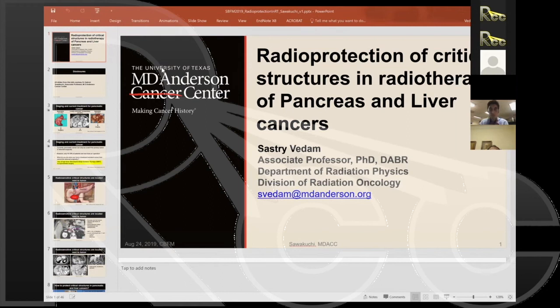Okay. But that being said, we also have the MR Linac now at MD Anderson. So that provides another benefit in the sense that you're able to achieve greater soft tissue contrast and real-time adaptive treatment. And so that's really opened up this trial to all these possibilities. Right.